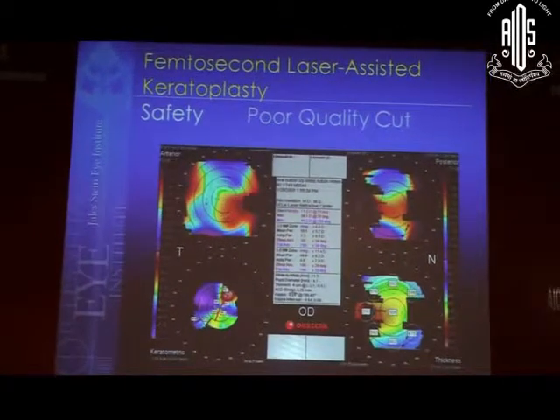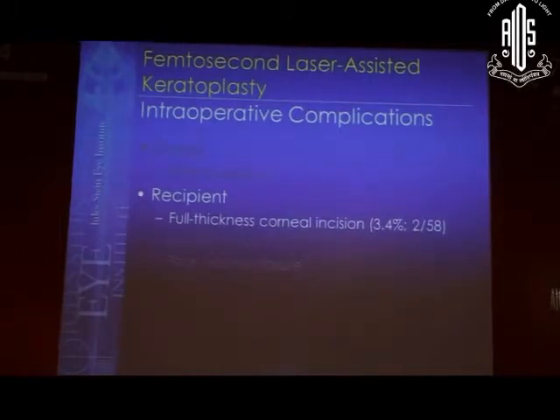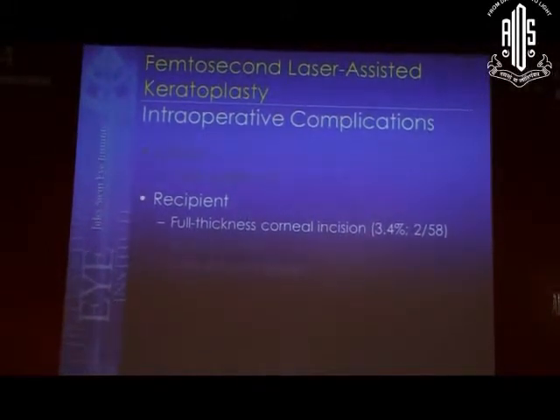It's only one case, but it does show that you can sometimes have issues with preparation of the donor, even with a femtosecond laser. As far as recipient intraoperative complications, full thickness corneal incision has occurred in 2 of the 58 cases, so 3%. And here's one of them.